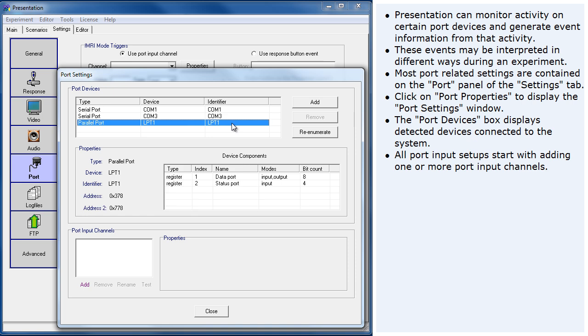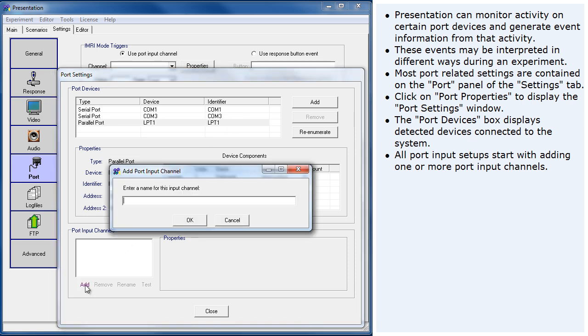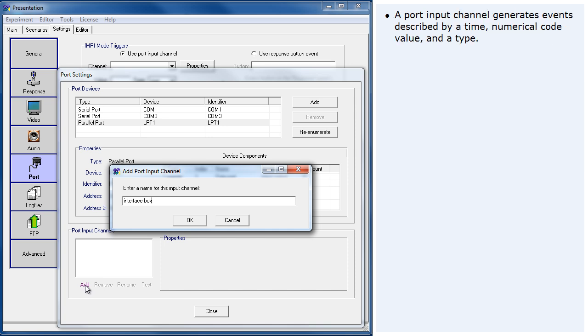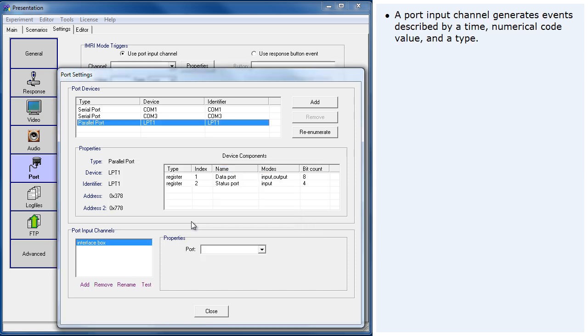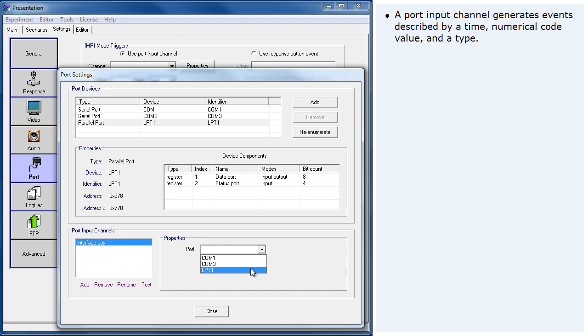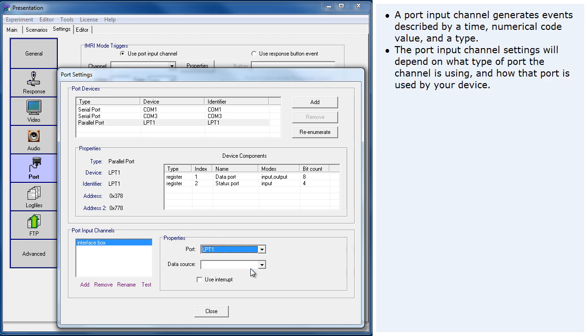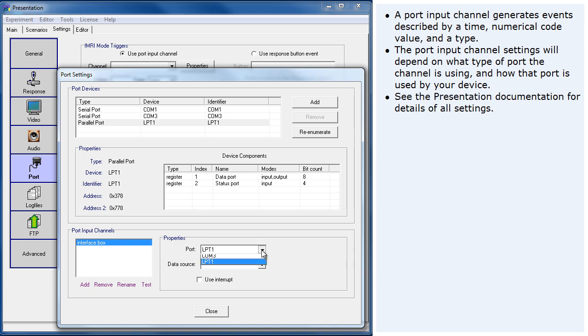All port input setups start with adding one or more port input channels. A port input channel generates events described by a time, numerical code value, and a type. The port input channel settings will depend on what type of port the channel is using and how that port is used by your device. See the presentation documentation for details of all settings.